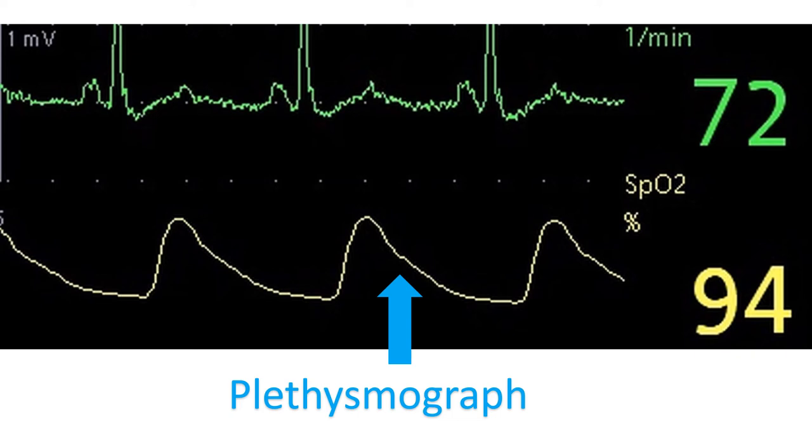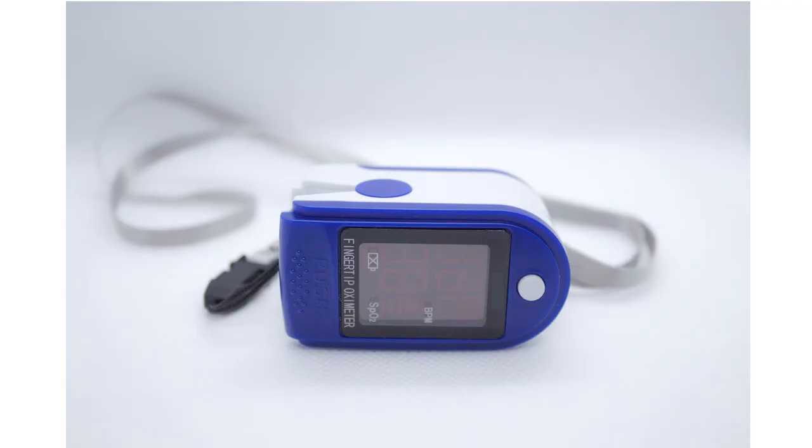The plethysmograph is obtained usually by keeping the sensor on the index finger and connecting it to the bedside monitor. Other than pulse oximeters attached to bedside monitors, small pulse oximeters are available, which can be attached to the finger and the person can walk about. This is useful in monitoring the response of pulse rate and oxygen saturation to exercise. Multi-wavelength pulse oximeters can detect dyshemoglobins.